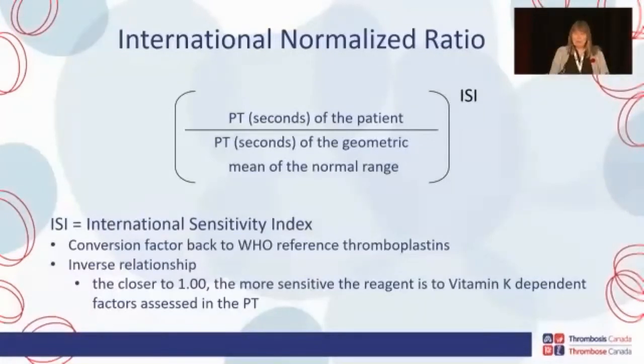And I'm old enough to remember that transition. And so we transitioned to reporting the PT in the INR. And I'm going to get on my little soapbox because the INR is not a laboratory test. The INR is the reporting unit of the prothrombin time in seconds. All right. So I get off my soapbox very, very quickly because I'm just as guilty as calling the PT the INR as everybody else in the world. But it is a reporting unit of the PT in seconds.